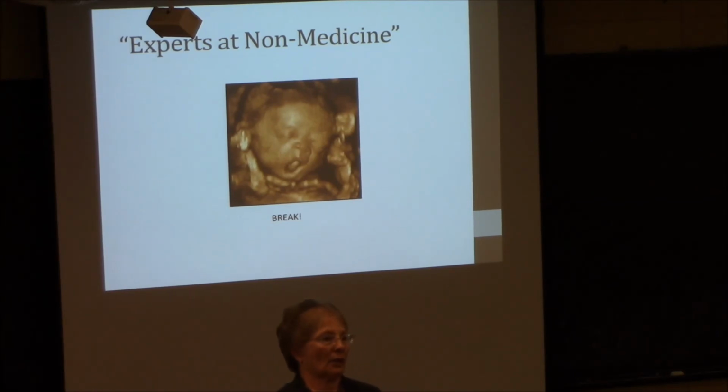We have access to all the image data. What we don't have access to is the string of unprocessed data that actually gets acquired. If you think of that CT as you're going around, there's probably 1,000 times that tube goes off and 1,000 detections per line that happen, and then that forms a sort of sinogram of all the raw data, and then it gets reconstructed into an image. Image is no problem. Sometimes the raw data is.